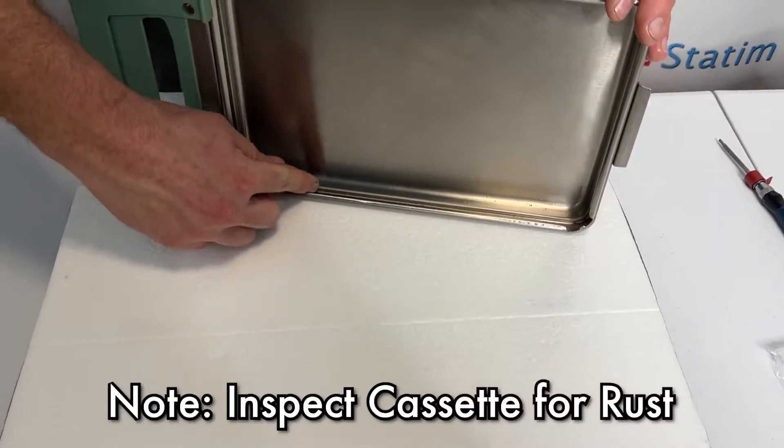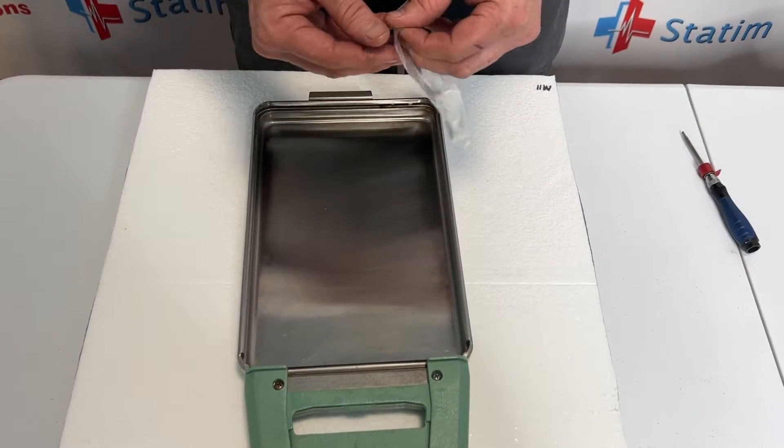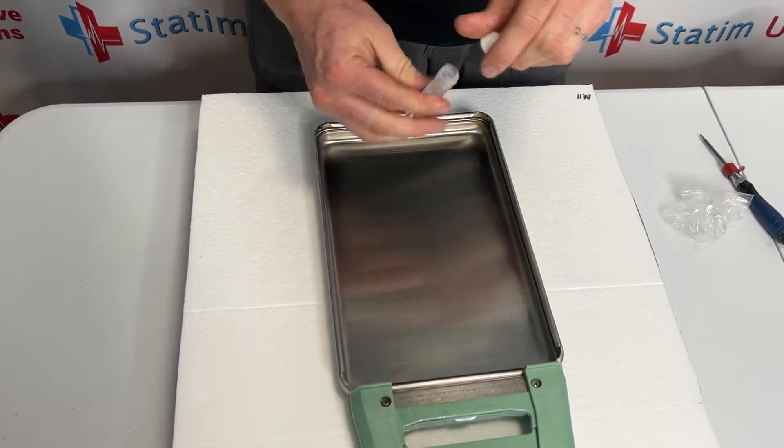We want to look where the cassette seal goes and make sure there is no rust. This one looks really good. I'm going to take the provided lubricant for the new seal and I'm going to pour about half this vial into the middle of the cassette.